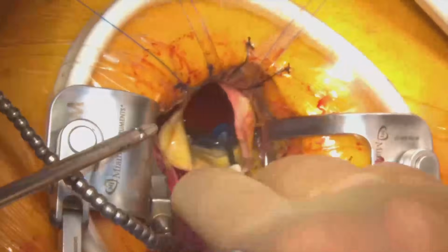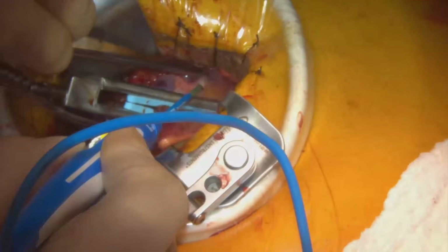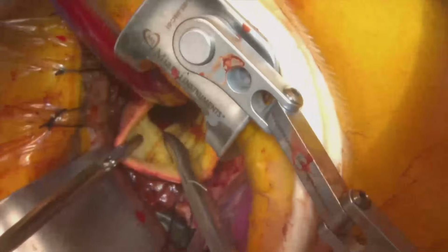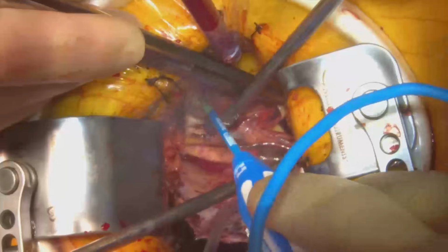The valve was then sized to a 27 mm mechanical aortic valve. Once we reached a core body temperature of 25 degrees Celsius, the pump was stopped and the cross clamp was removed. The aneurysmal segment was dissected and excised.